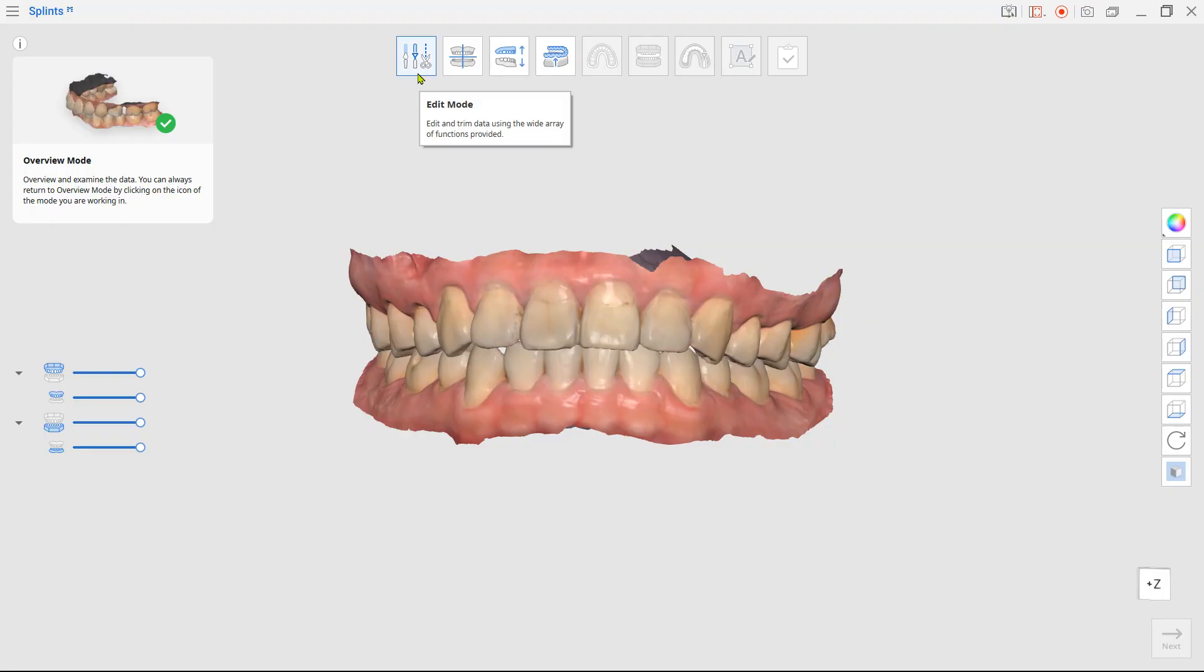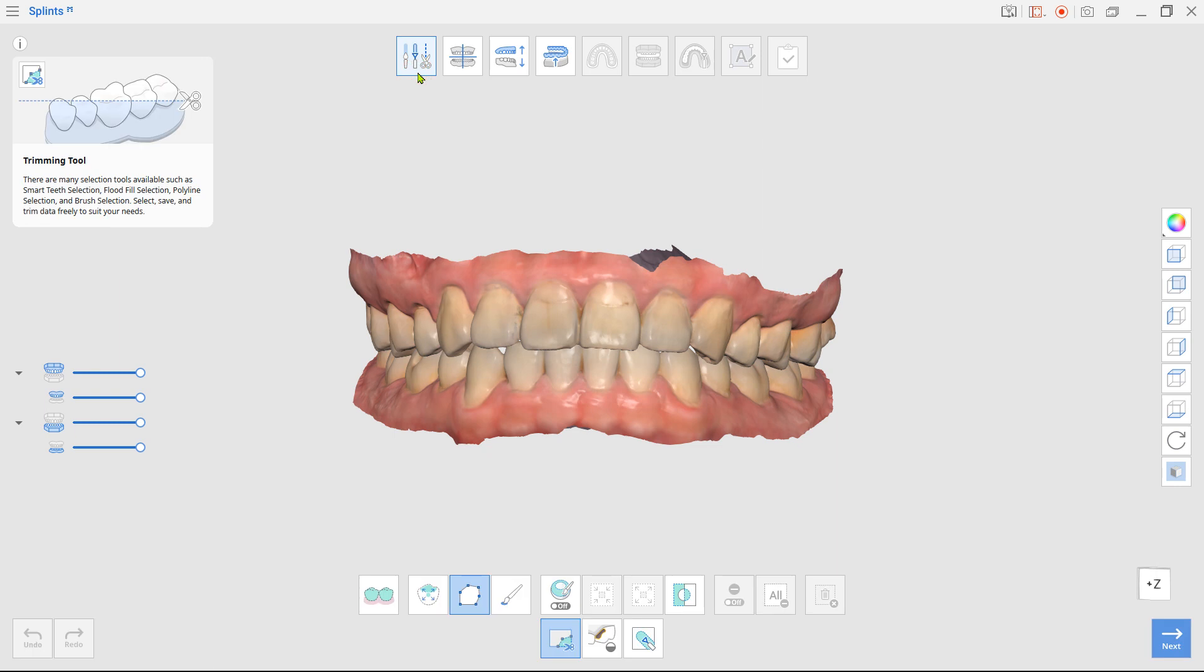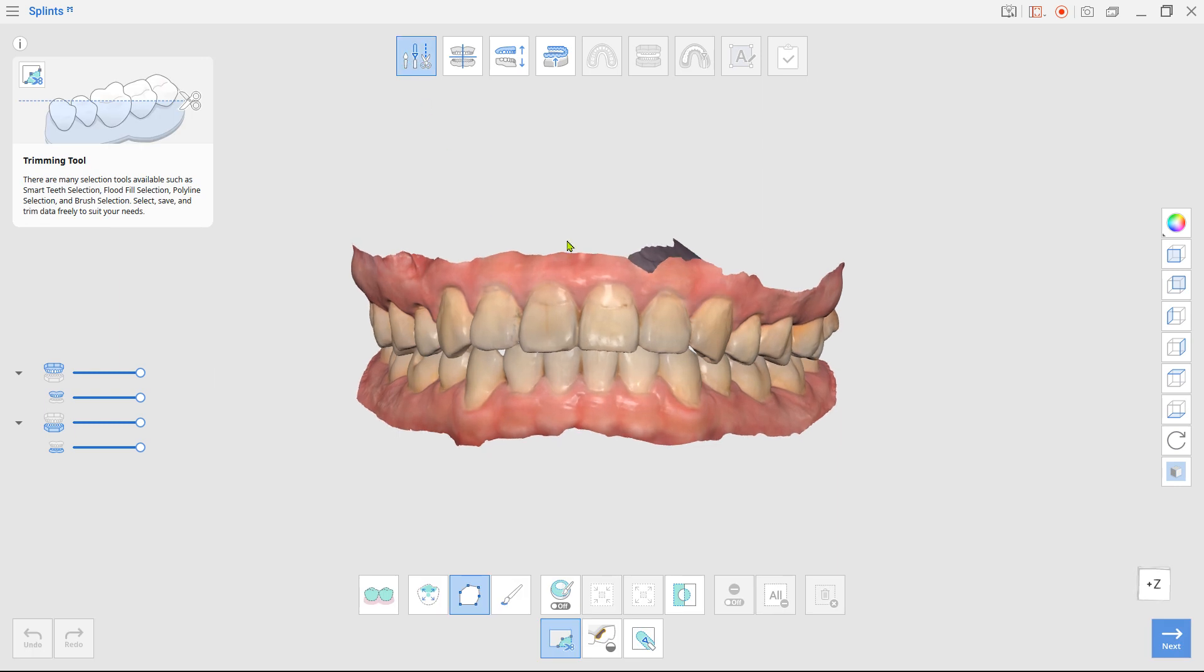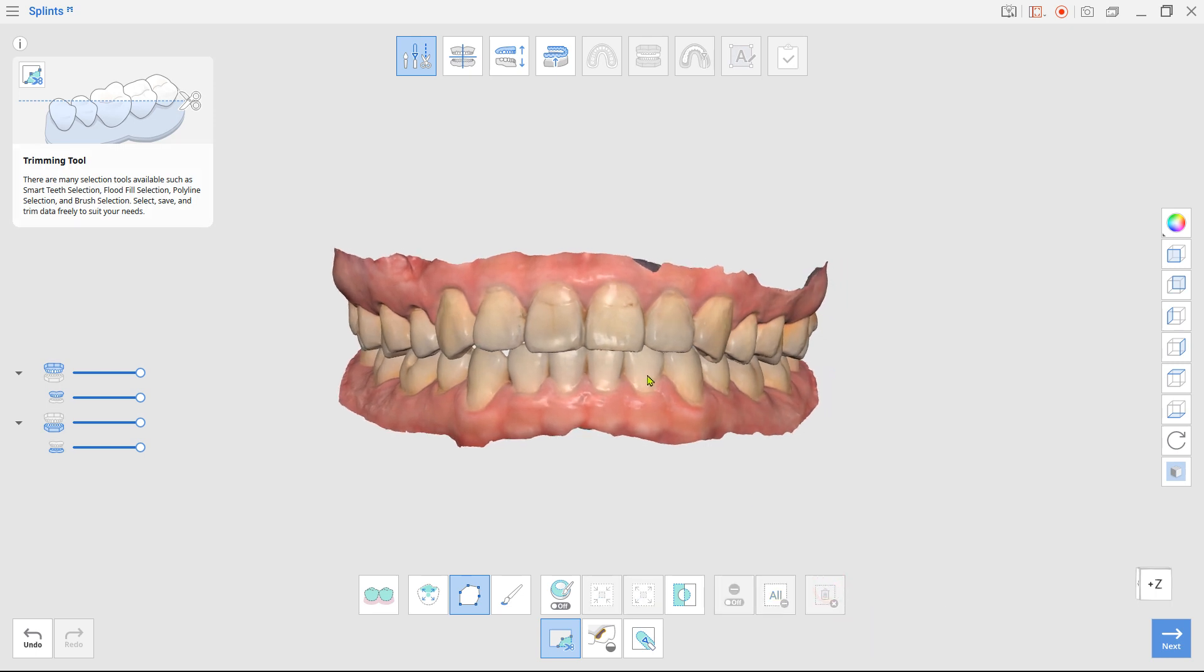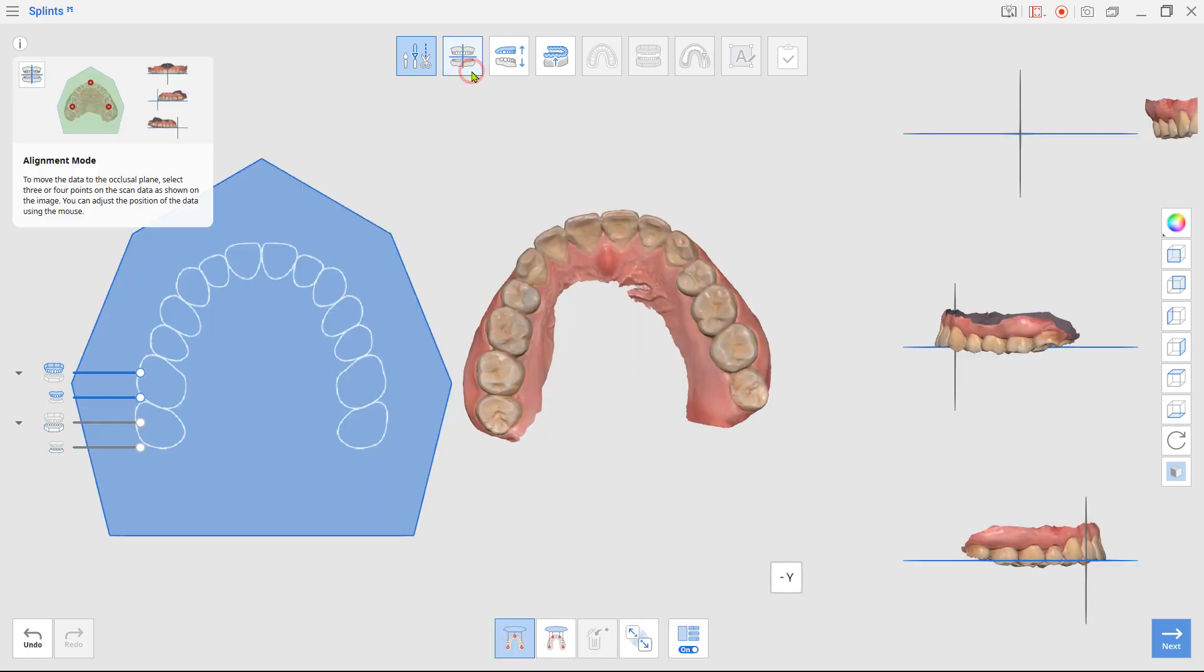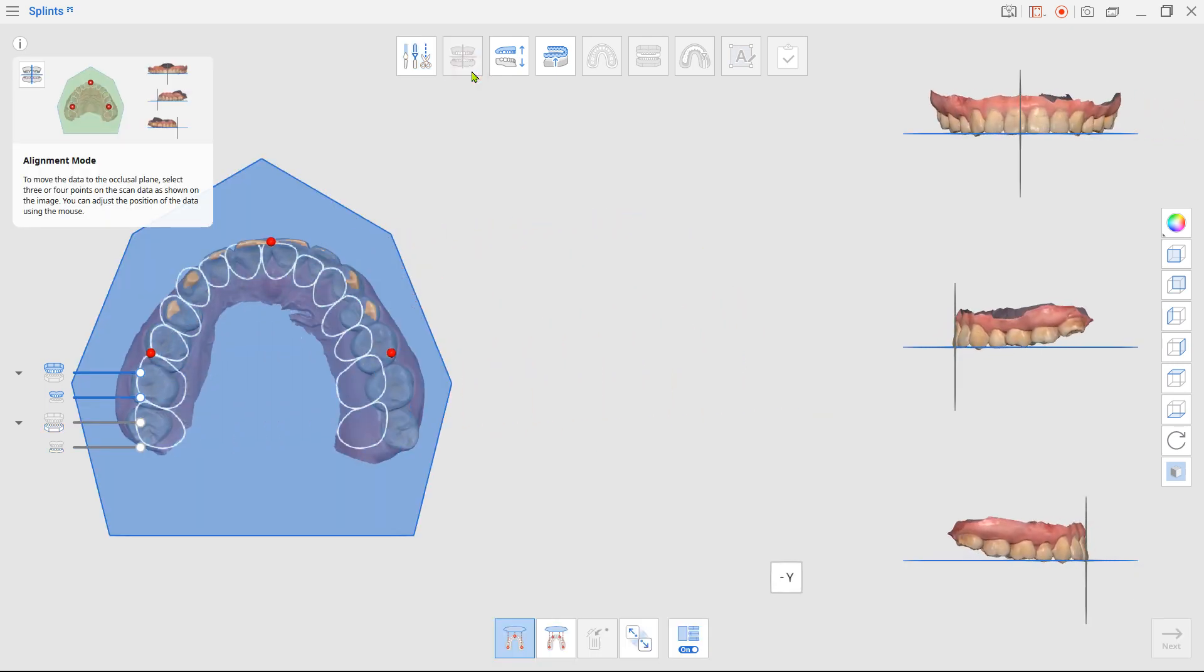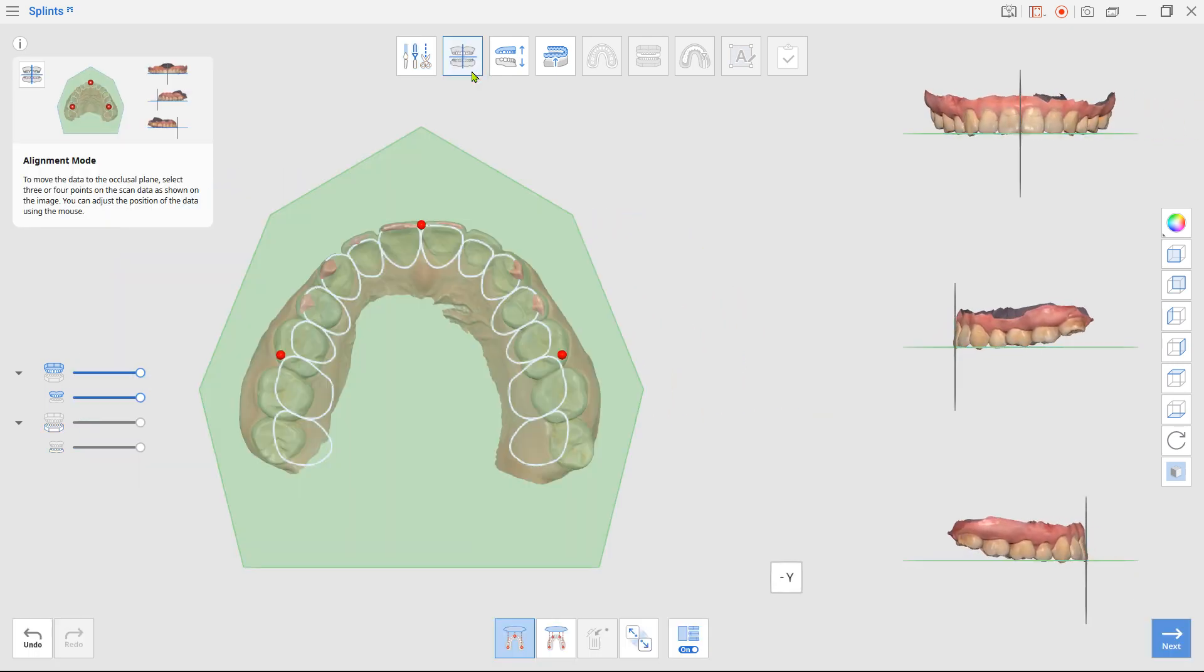If your data needs trimming, enter edit mode and use the provided tools. In the alignment mode, the app will automatically align the arch to the virtual occlusal plane.